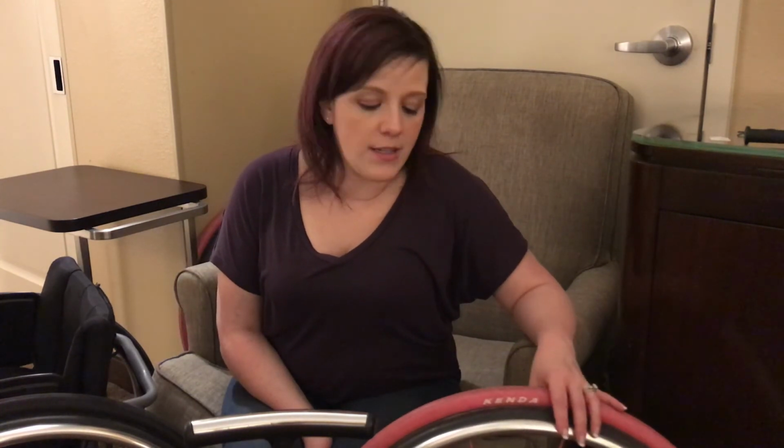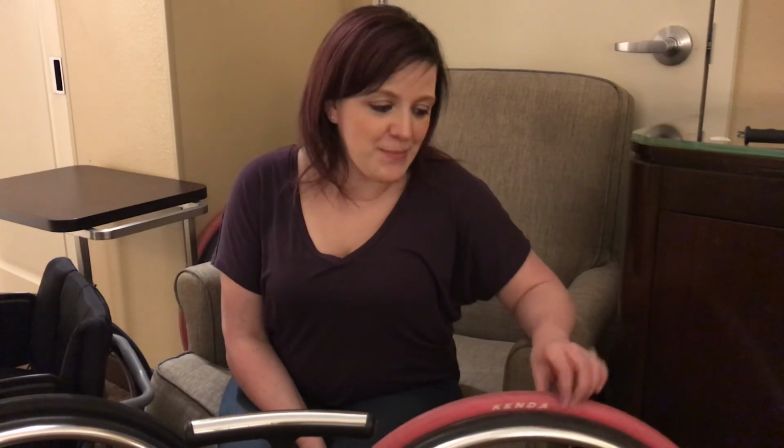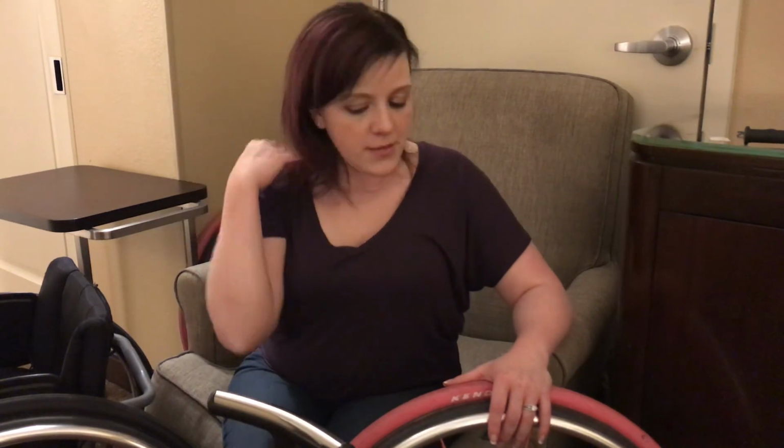But again, if you're going to travel, keep the tools on you, because you never know when you might end up having a flat tire. Anyway, hope this helps. I'm about to go to bed because I have to get up really early tomorrow to go speak here in Memphis. But yeah, I see why I pay people to do this for me now. But I did it. It's done. It's usable. And I would, again, invest in a manual pump and an electric pump, just so you have both. It's much faster to use an electric pump than to do it manually, and it's just easier physically. You don't have to do all the work that you have to with a manual.